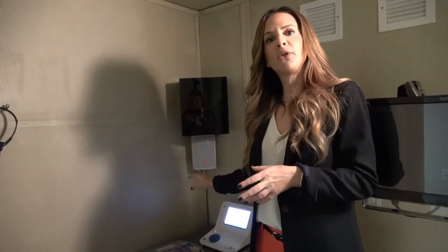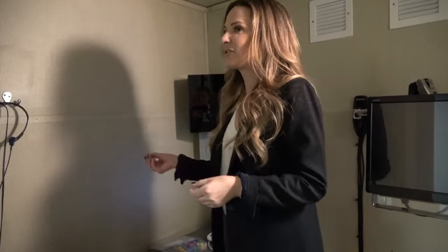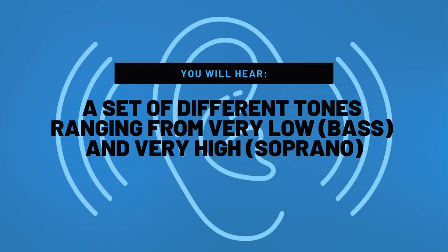Once we do this on both sides, we will then put insert earphones inside your ear, where you're going to hear a series of different tones. Those tones range from a very low, like a bass, to a very high, like a soprano sound. The reason why we test that particular range is because that's where all the speech details are encompassed. The human ear is actually able to hear from 20 hertz all the way up to 20,000 hertz. But here in our testing capabilities, we only test from 250 all the way up to 8,000.